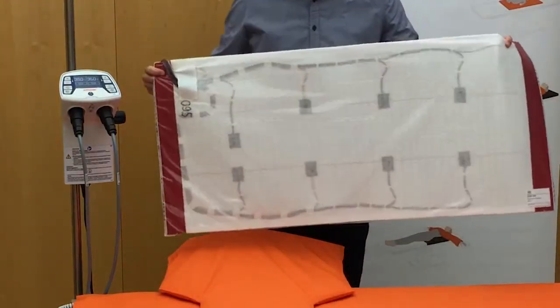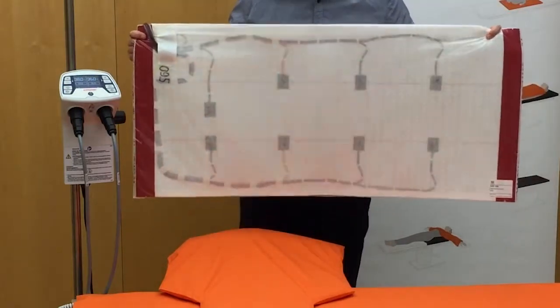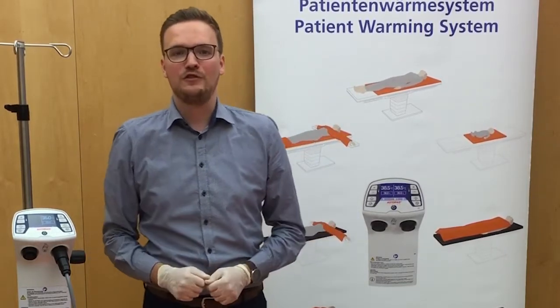Each blanket is designed with up to eight temperature sensors for patient safety and precise temperature control. Before use, the Astopad patient warming system should be cleaned and disinfected according to the instructions for use provided with the controller.